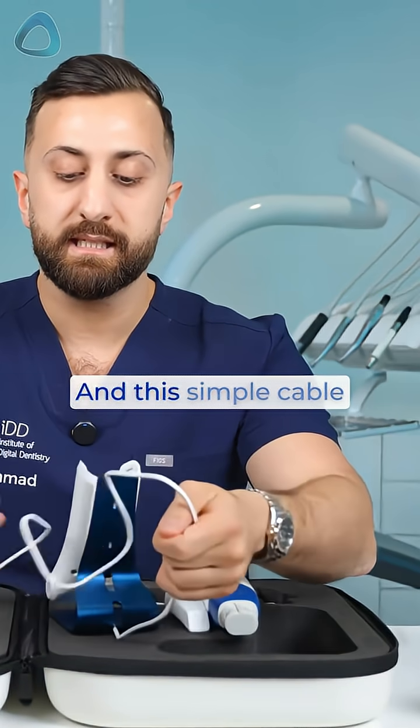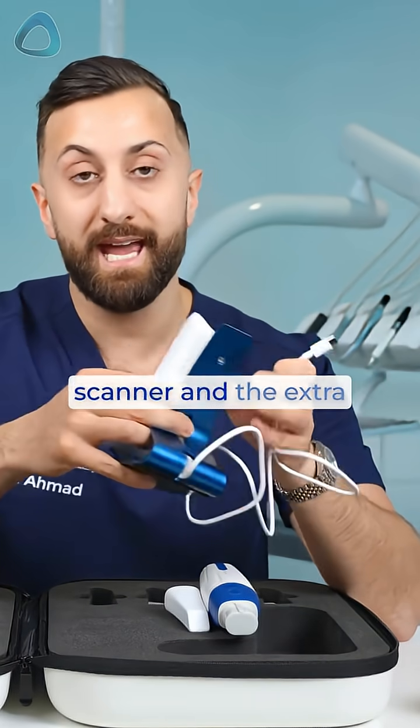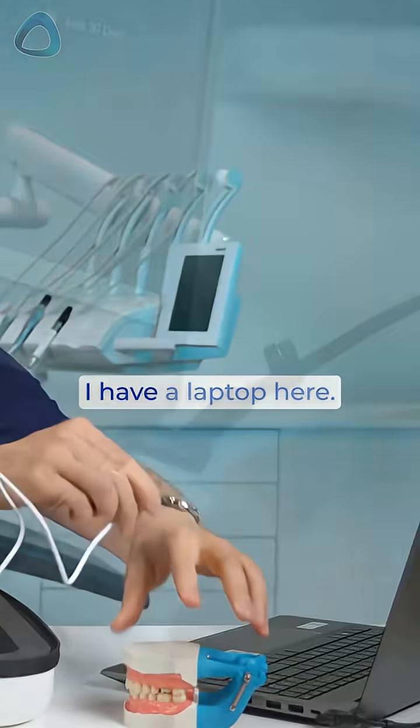This simple cable is how you're going to charge your wireless scanner and the extra battery housed in here. We can plug this in — I have a laptop here.